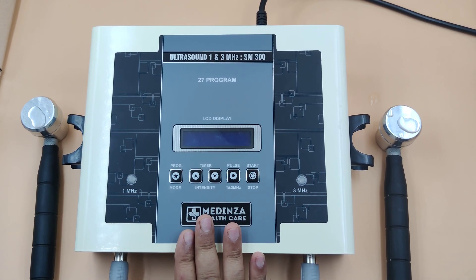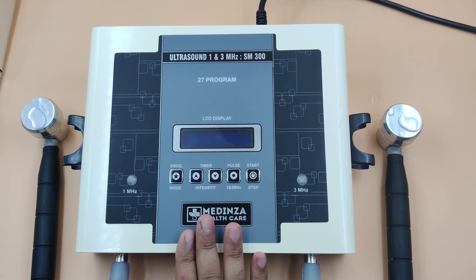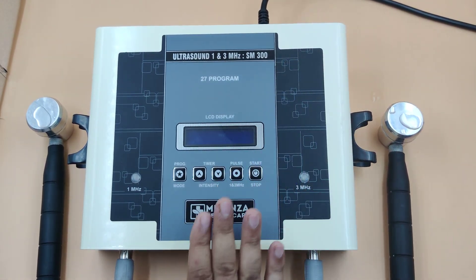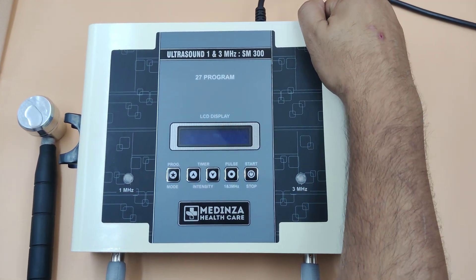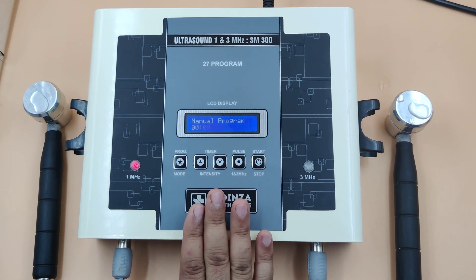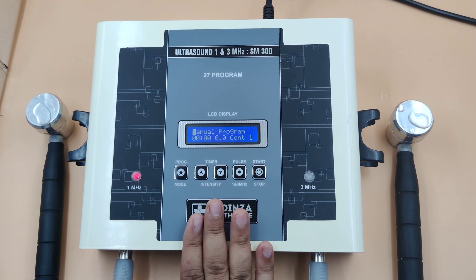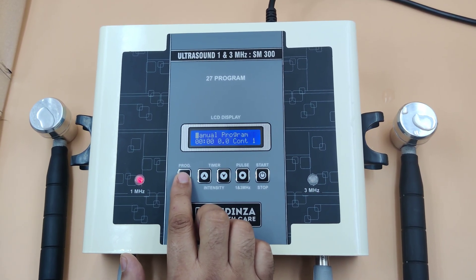I will show you the demo of the ultrasound 1 and 3 megahertz LCD unit, model SM 300. It has 27 programs along with a manual program. Switch on the machine and attach the probe wire. Start with the manual program — you can set all details as per your need. Press the mode button to start the manual program.